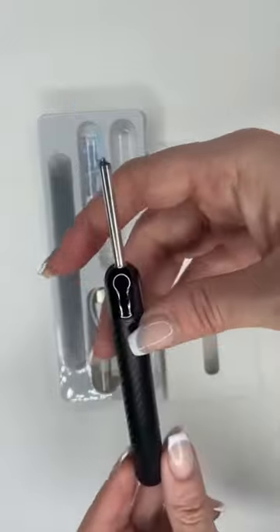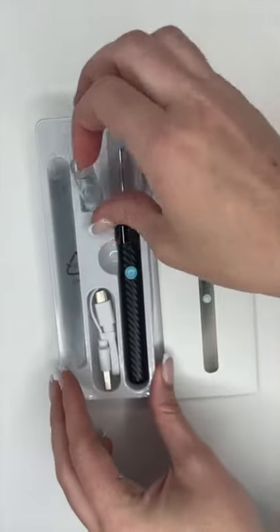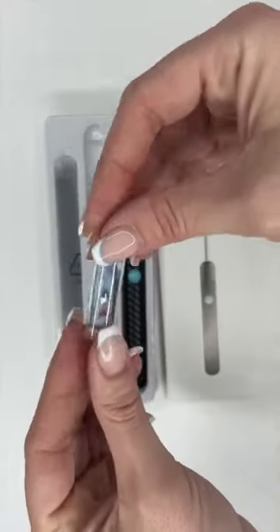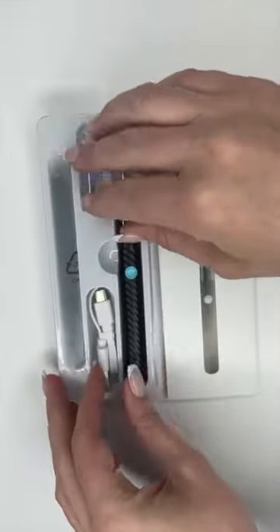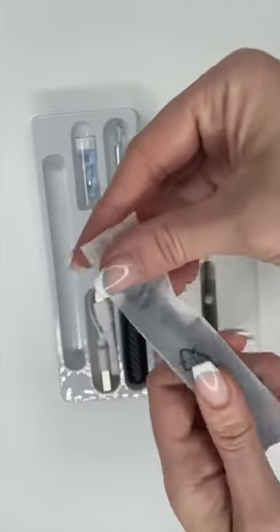I do want to put a disclaimer on this video. I am a licensed audiologist, and later on in the video I will be demonstrating an ear cleaning. I do not recommend that the general public try cleaning your ears at home. With that being said, let's dive right in.